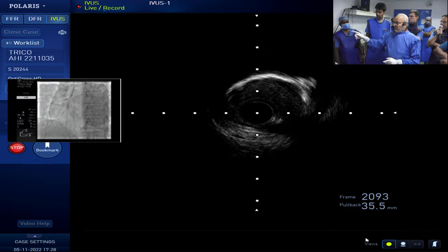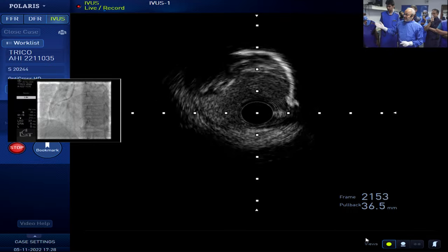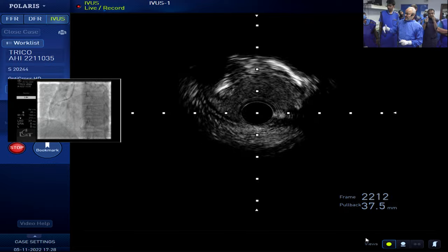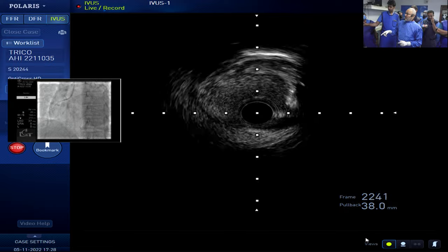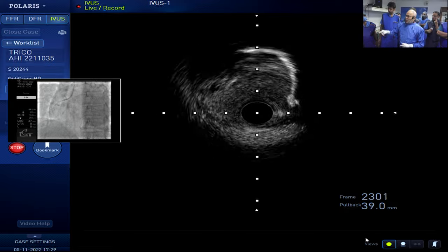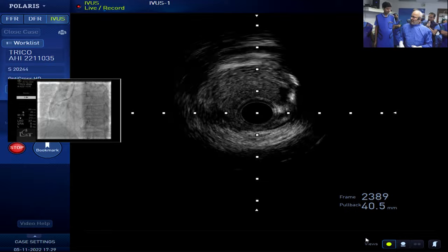I don't think there is a stent. The history has been given to us — the patient has come from outside. Probably this looks to me like a de novo lesion. Yes, I think so.